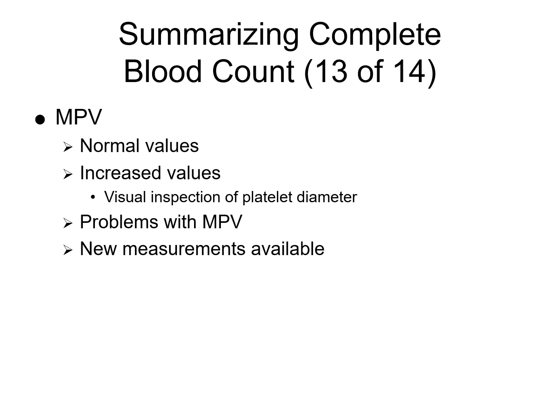Continuing on with the MPV, your normal values will typically range from 7.5 to 11.5 femtoliters, and it may vary slightly by lab, but that's the general range. Increased MPV values can indicate larger platelets, may reflect increased platelet production or younger platelet populations, and can be seen in conditions like immune thrombocytopenia, recovery from thrombocytopenia, and even some myeloproliferative disorders.